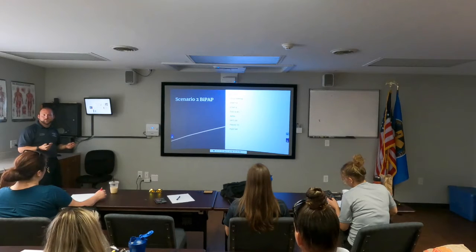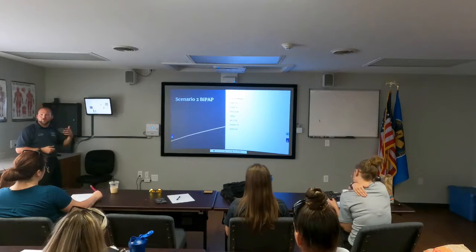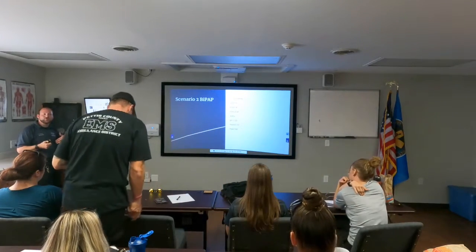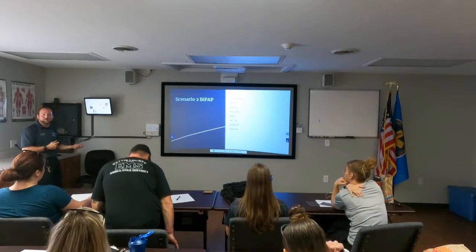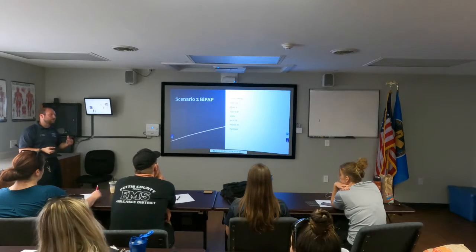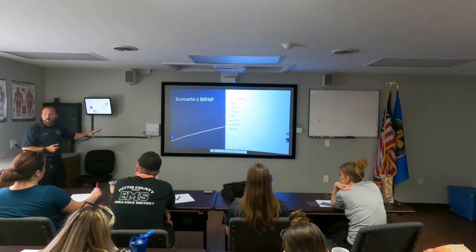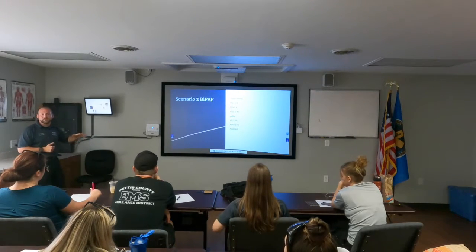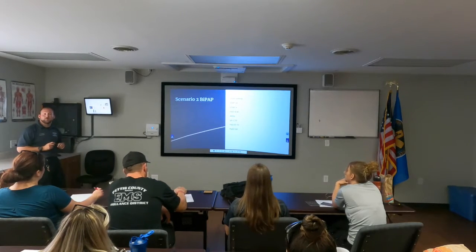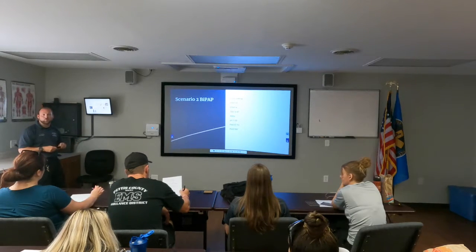35 to 45. Yep. So what we see on our monitor when we do our end tidal, that number of 35 to 45 is actually based upon ABGs. True respiratory CO2 is going to be a little bit lower than that, but not by much, so we can still account for 35 to 45. PaO2. Is this low, or high, or where it needs to be for this patient? This is low. PaO2 should normally be between 80 and 110.